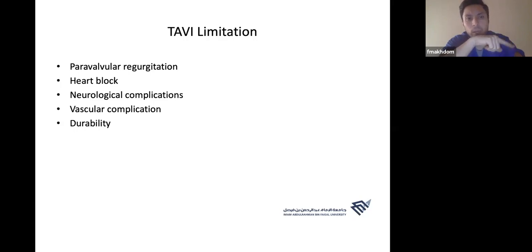You will notice that paravalvular regurgitation was a big deal and very common in the first generation. The presence of paravalvular regurgitation more than mild was associated with a longer intermediate or long-term mortality. So this was the Achilles heel, let's say, for TAVI back in the days. Now you will notice again in the literature that paravalvular regurgitation incidence has decreased dramatically.